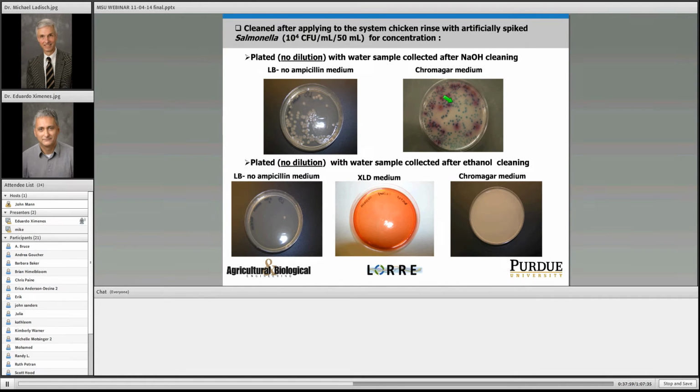Very critical, and you can see in the 3 pictures below that all the solutions are fresh during this step and sterilized.